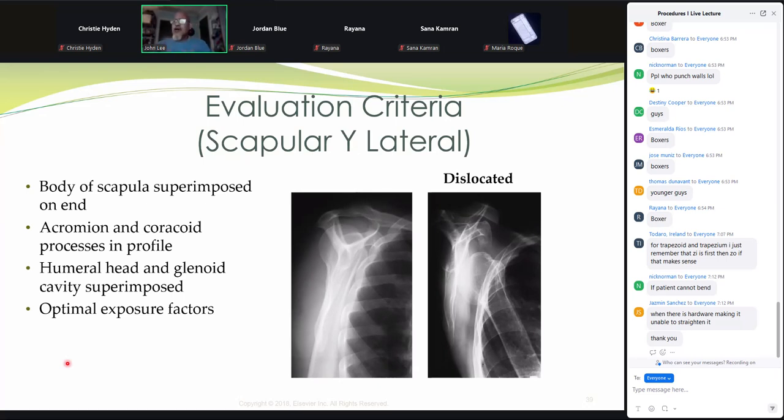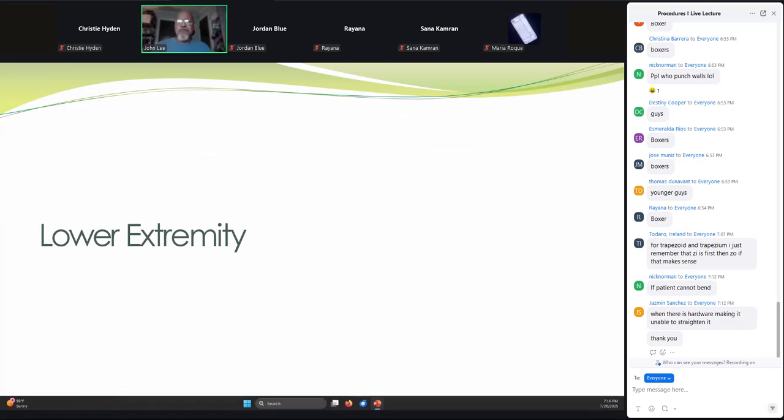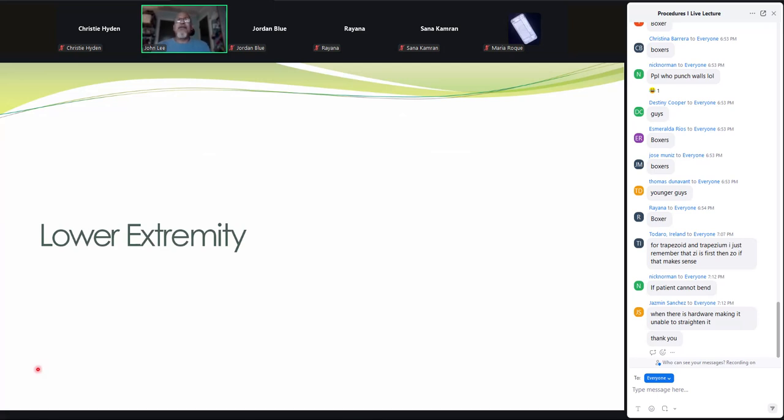That'll allow you to drop the dose down. Collimate tight. I'm a big proponent of manual techniques. It takes practice and diligence to become a good techniquer.